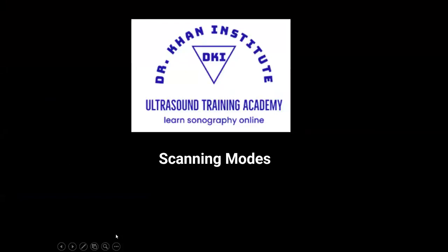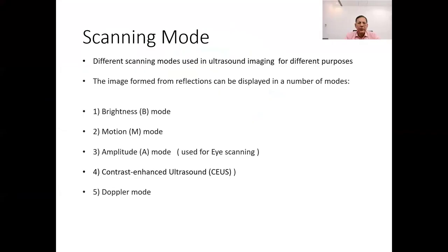Hello everybody. Today we will discuss different scanning modes for ultrasound imaging. Different scanning modes are used in ultrasound imaging for different purposes. The image formed from reflections can be displayed in a number of modes.